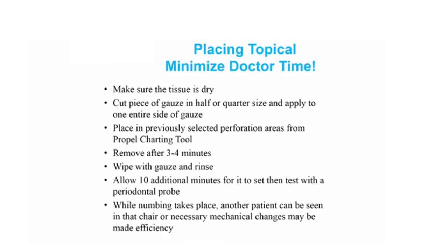They're going to dry wipe it out, then rinse it. Now we don't want to do the propel right away after we rinse off the gauze because they don't have full anesthesia yet. Enough topical has soaked underneath the gum tissue that we're still getting a pharmacological effect even after we rinse it off, but it's going to take about an additional 10 minutes to get full anesthesia. So be patient, don't do the propel right away, but you don't want to waste that chair time.